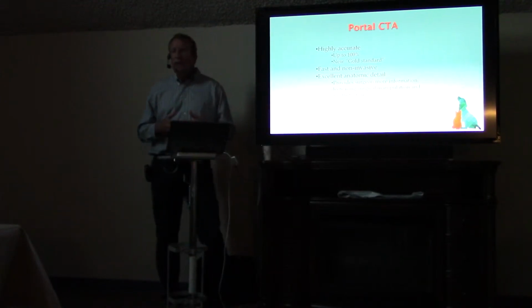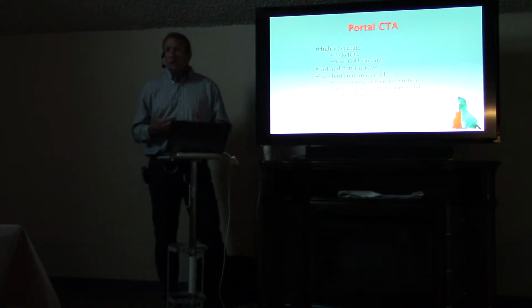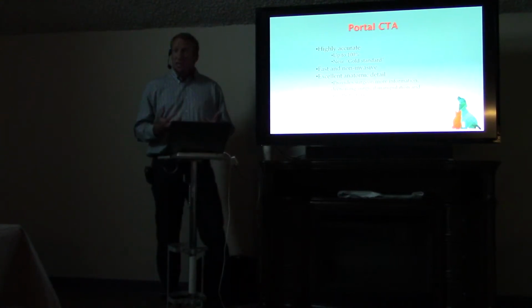Not saying that I recommend a CT scan for every dog that may or may not have a portosystemic shunt. I think that ultrasound is still the primary imaging method that should be used. The cases where I recommend CT angiography are cases where I can see a shunt, but there's something weird about it and I don't know what it is. And if I think it might make a difference to a surgeon, then I might recommend a CT angiography to identify that shunt in a little bit more detail, where it's going, and give them that information.